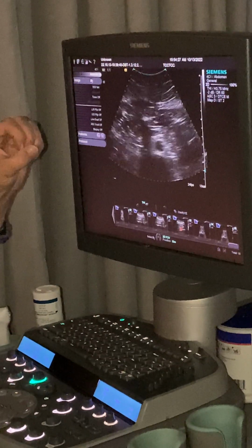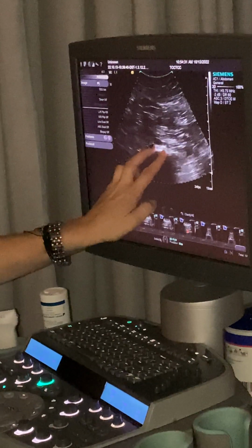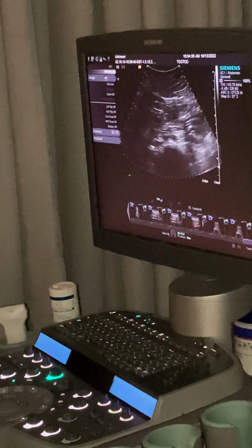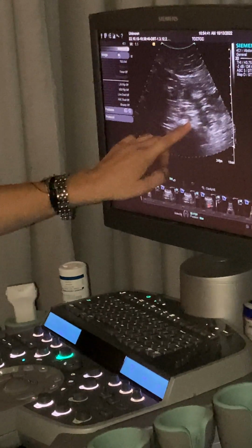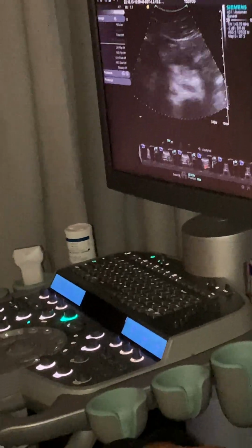And so it's going to go from one circle into two circles. So one circle, and then you see how it splits into two? So there's our bilat iliacs. So it looks like a little frog face. Transverse. Correct, yeah. So you can always use this and then just follow one of them to determine whether you're on the left or the right.